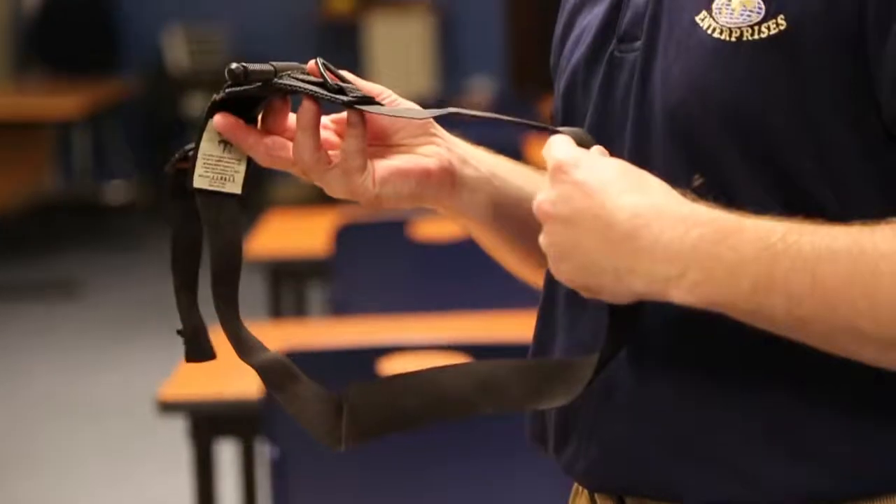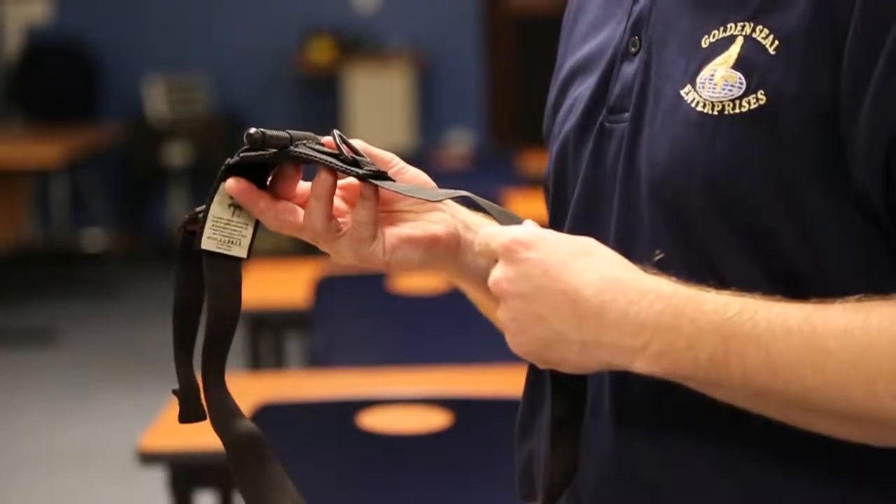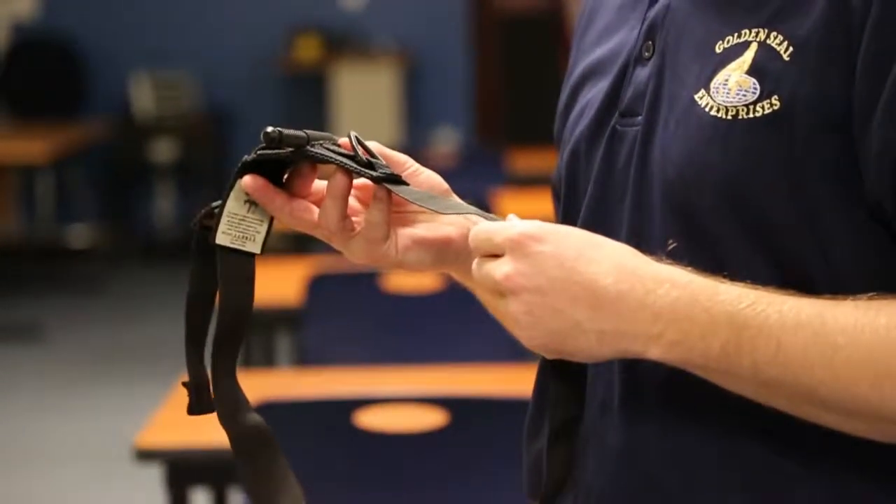Tourniquets are the most accessible and effective means of controlling external or massive hemorrhage from an arm or a leg. They work by providing a circumferential band that goes around the arm or leg in order to provide sufficient pressure to collapse the artery in that arm or leg and thus stop bleeding.